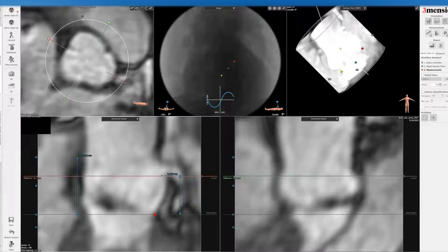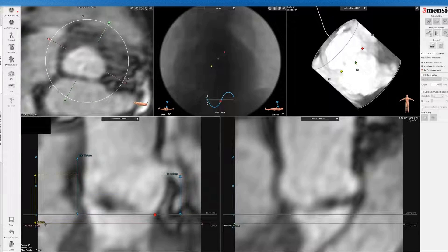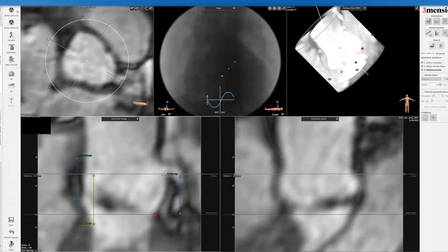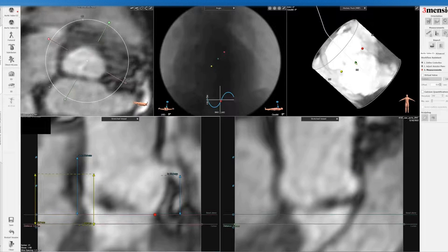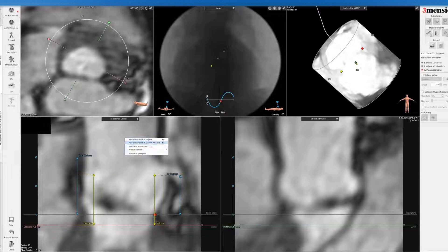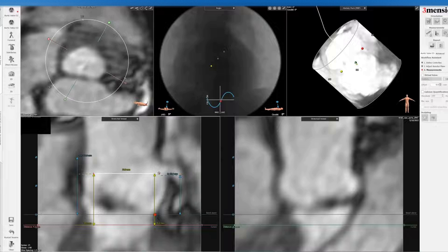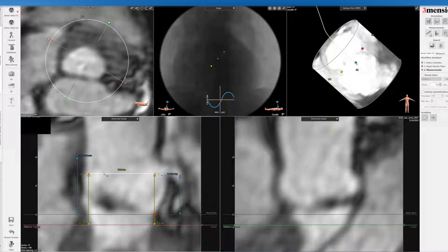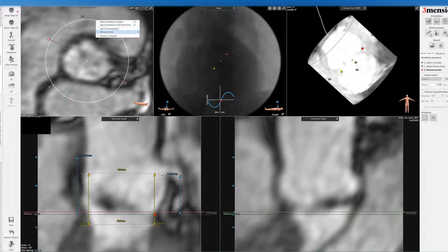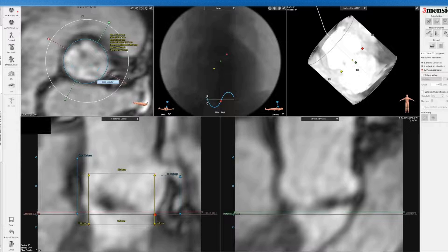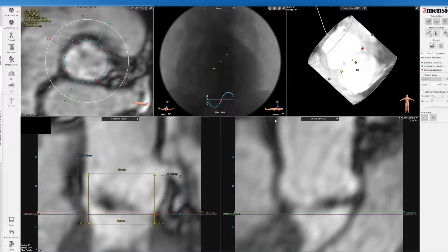You can also do a segmentation with the virtual valve. If I select a balloon-expandable valve, you can see that this patient would fit a 26 millimeter device. You can set a 20 millimeter height — that's the nominal expansion of a 26 millimeter balloon-expandable valve. Now I'm going to do the one millimeter cuts with the circle representing the valve. I'm going to make it circular and put it into a 26 millimeter circle — you can see that here — again doing the same one millimeter slice.